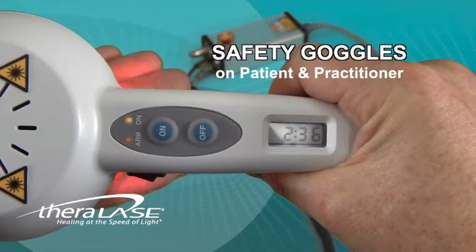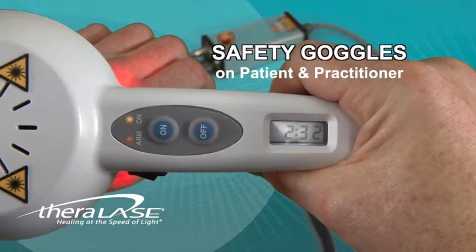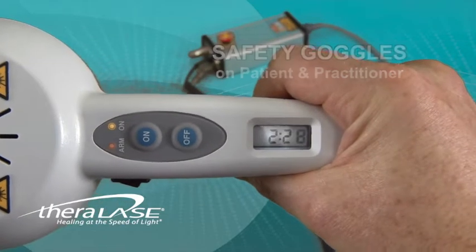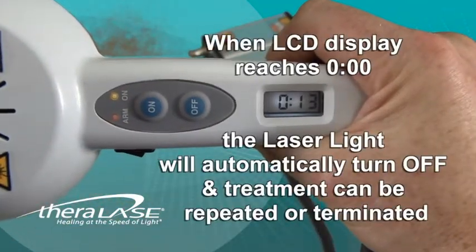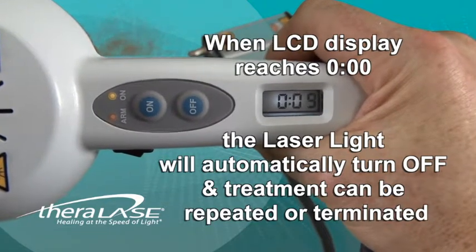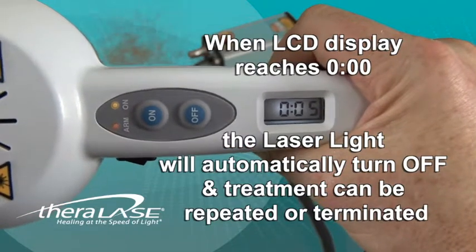We know the laser is on because we see the on light illuminated, and we can hear the internal fan. It's always good practice when using the laser for the patient and the practitioner to be wearing the Theralase laser safety goggles. When the LCD screen reaches zero, the laser system will return to standby, the laser will beep, and the treatment time in that location is complete.